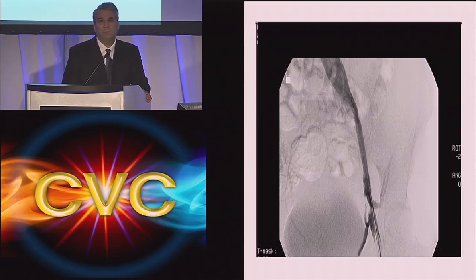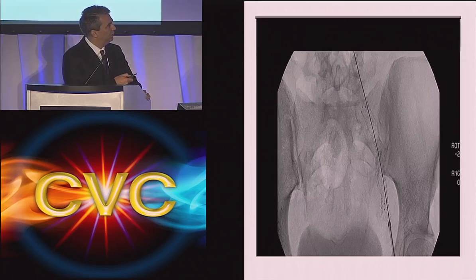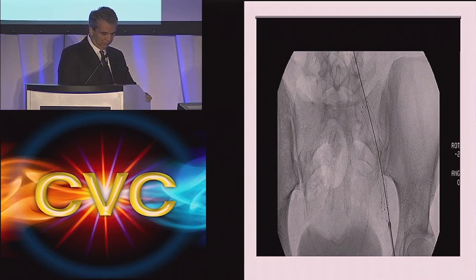Other major problem is that they don't understand the venous physiology, so they just use the material that they have on their shelves, and they don't choose the right stent to use. And what we see here is that the stent design is not in line, and this is a cause of rethrombosis because you have the turbulence of the blood flow coming from below, and the turbulent flow here will lead to rethrombosis.